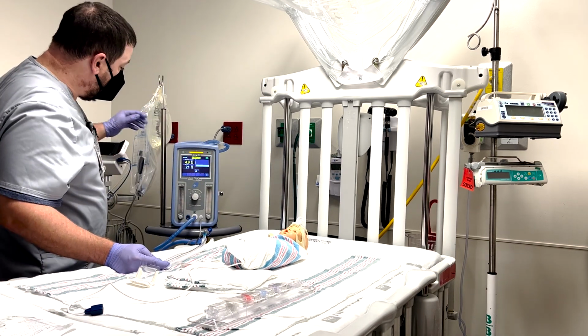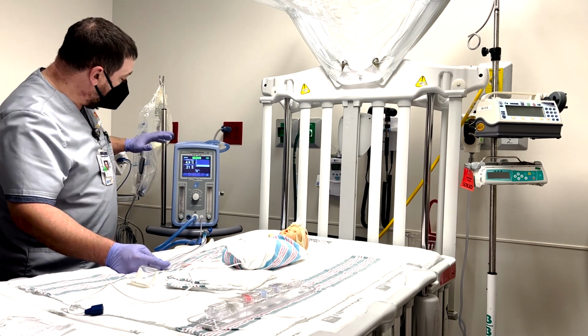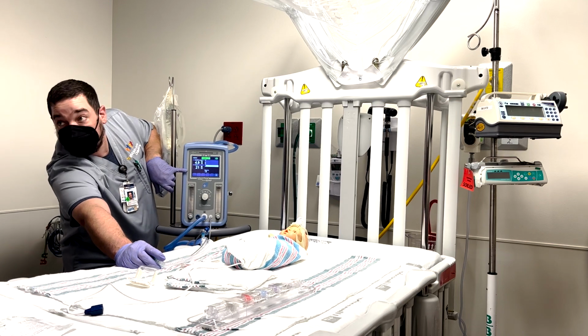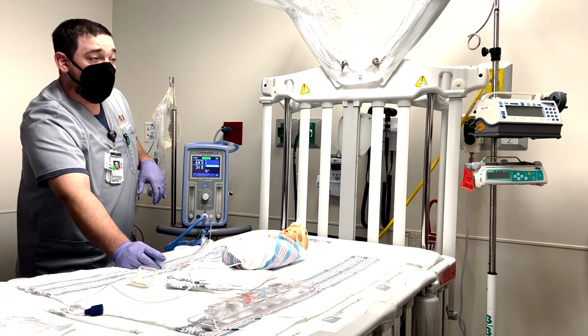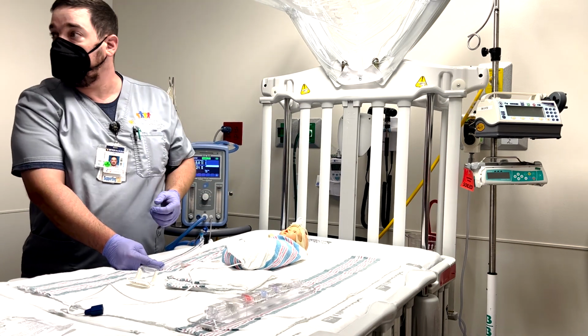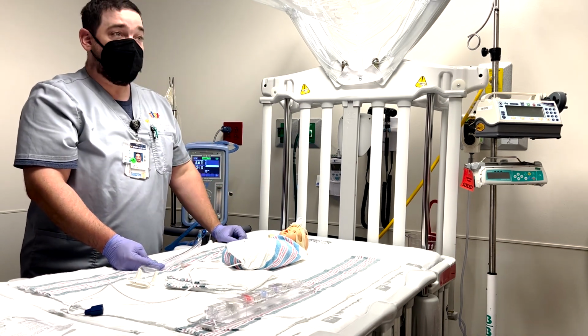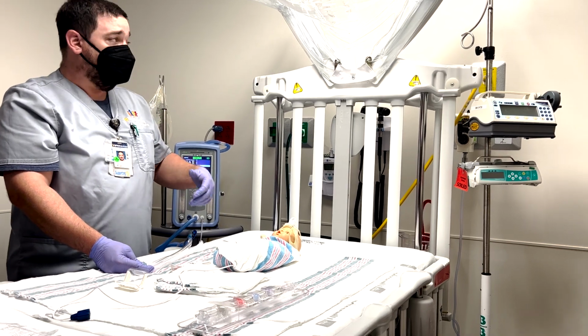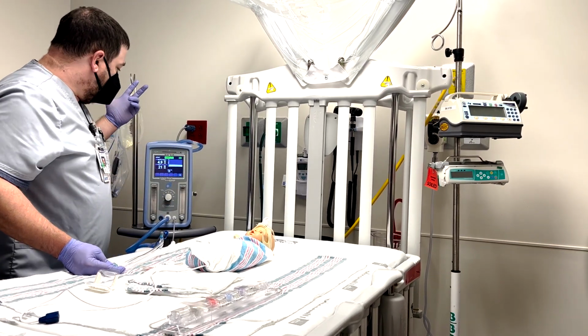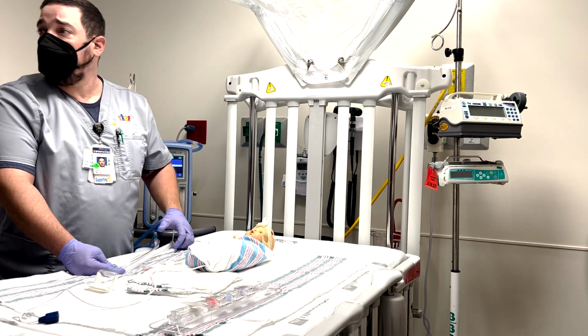What you need to worry about as far as giving nursing report is what PEEP am I on and what FiO2. That's it. So he's on nasal CPAP of 5 and 21%. That's what you need to know. And if you want to, what kind of secretions, what their breath sounds are like, and what the plan moving forward is going to be.